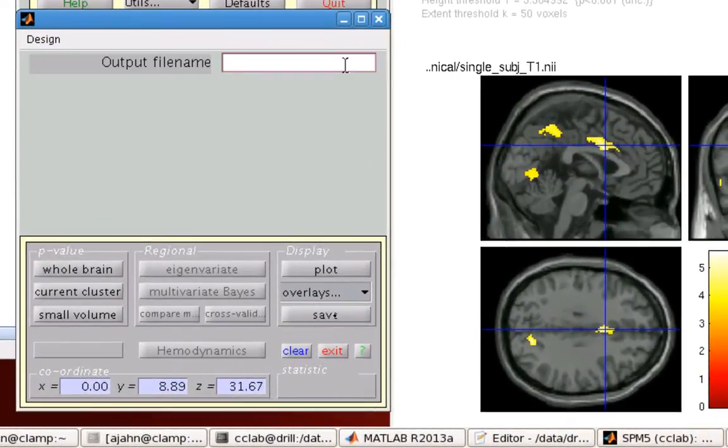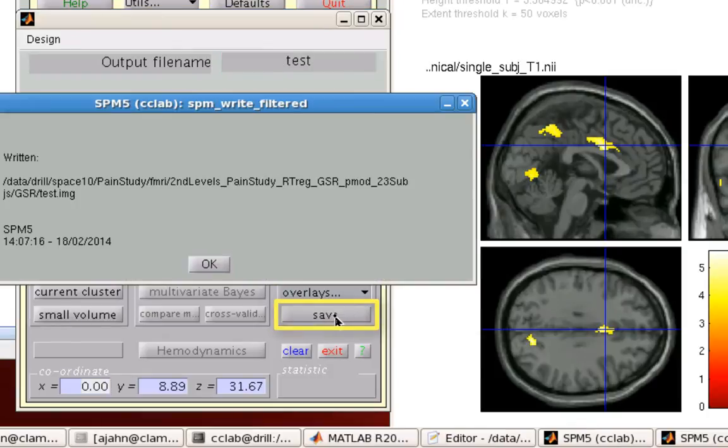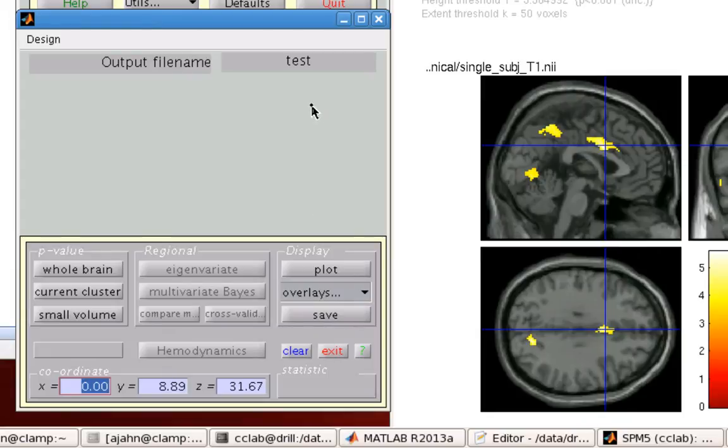However, you can also save this out into a folder, just like that. So you just click on save right here, output file name, and it will spit that out in image header format into whatever folder you want.